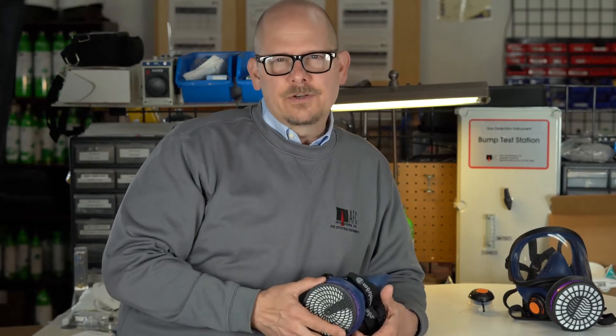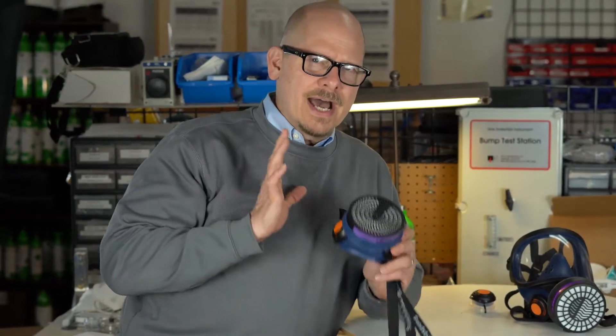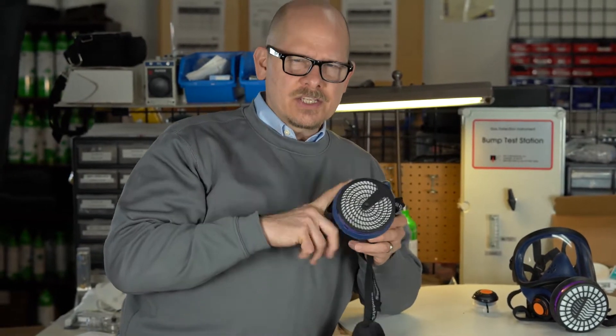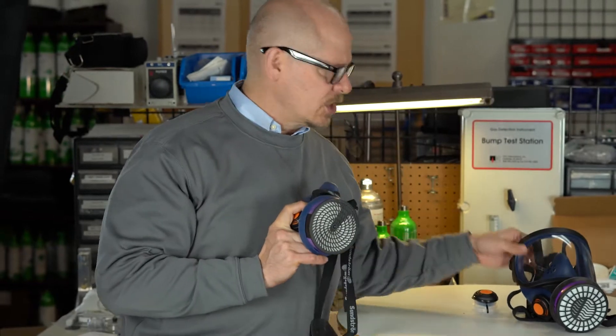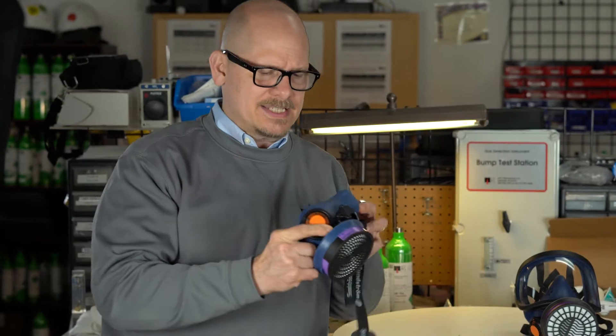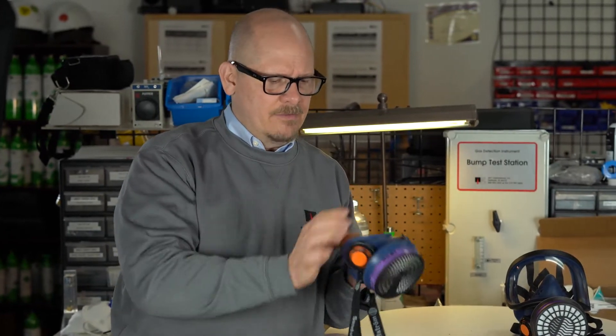Hi, this is Jim Sinesco for AFC International. Today I want to talk about how do you fit test — quantitative fit test — an SR100 from Sundstrom or the SR200 from Sundstrom, and really any Sundstrom mask that has the same exhalation valve setup.